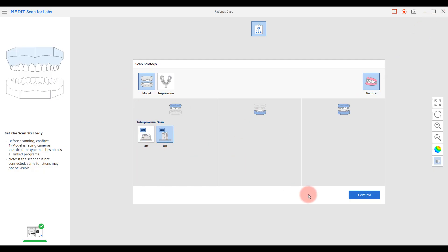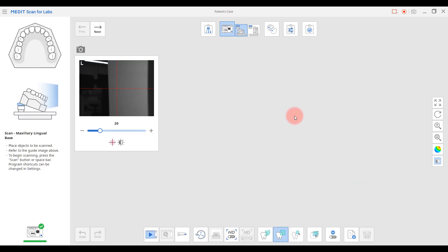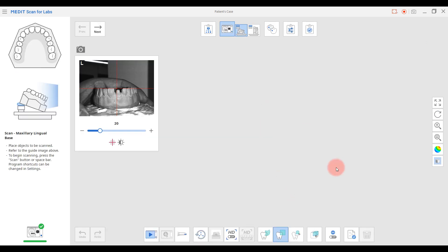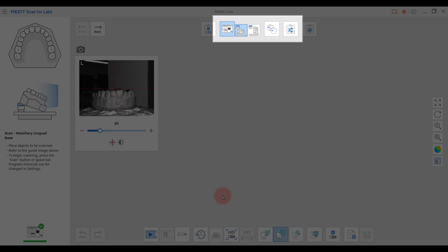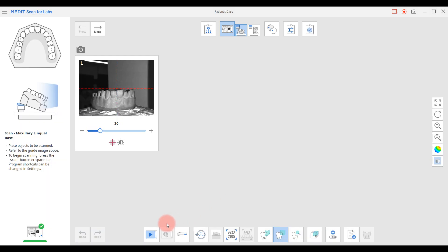The next scan strategy is Interproximal Scan On. If you select On, you'll get two scan stages: maxillary lingual base and maxillary buccal base. Please refer to the guide image on the screen and proceed with the scans.